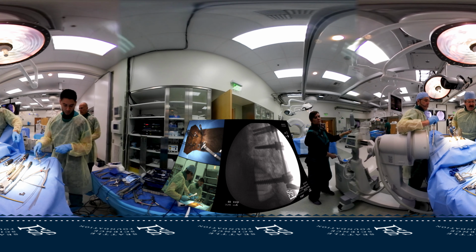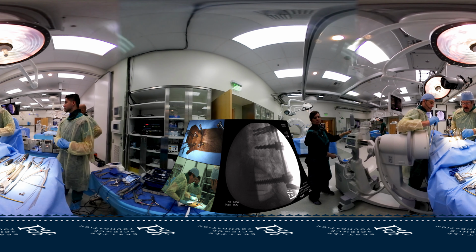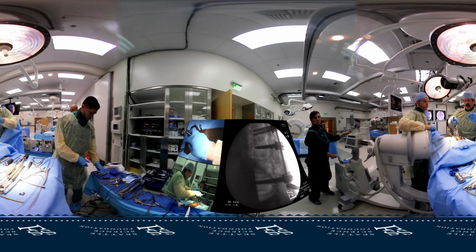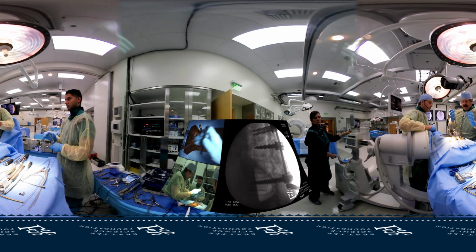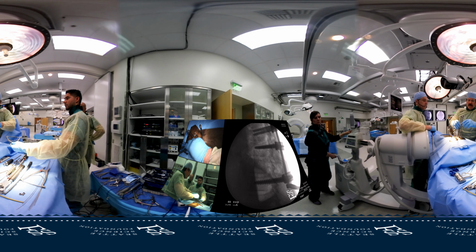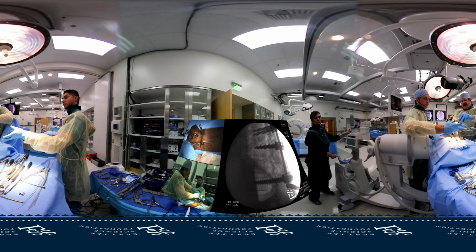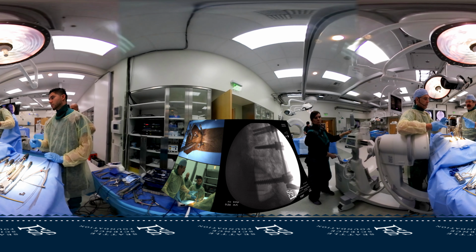Knife, you have the knife. I'll show you what I mean to do compression and distraction. I just got to make these holes a hair bigger. I try to keep my holes pretty small. If I'm doing MIS, I don't want to make holes any bigger than I really need to. Okay, and so what happens is this one comes with a device where I can pop this thing on the top, and this will keep those from coming together.